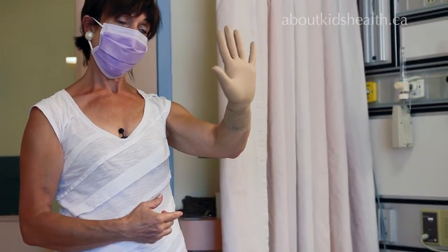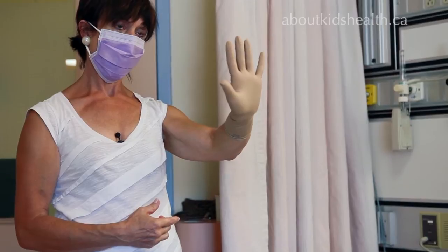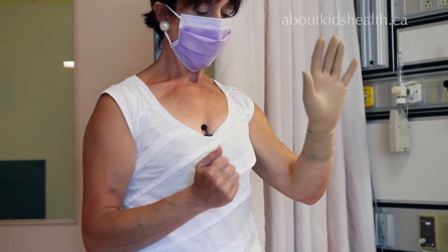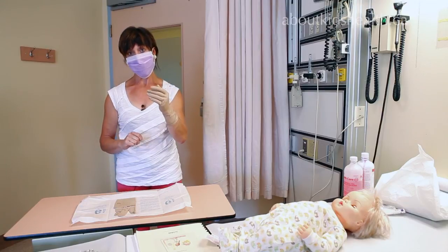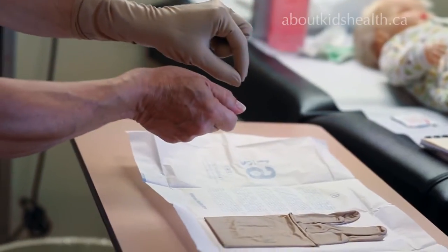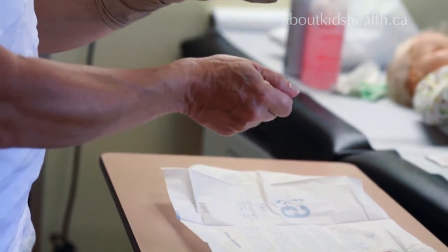With one sterile glove on, you are not allowed to touch anything unless it is sterile. So you can't touch it with your ungloved hand, but you can touch the second glove's packaging because it is also sterile. You cannot pick up the second glove the same way as the first, because the likelihood of contaminating it as you pull it on is very high.